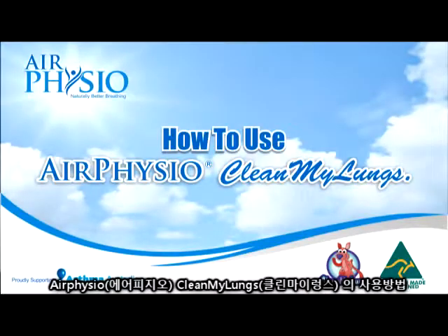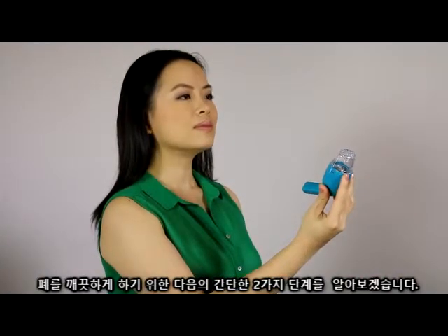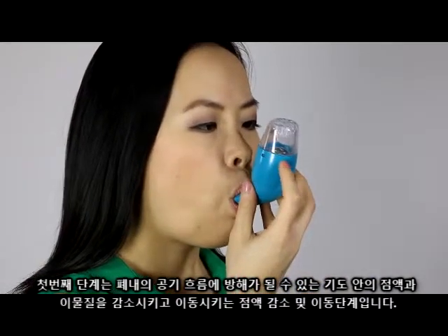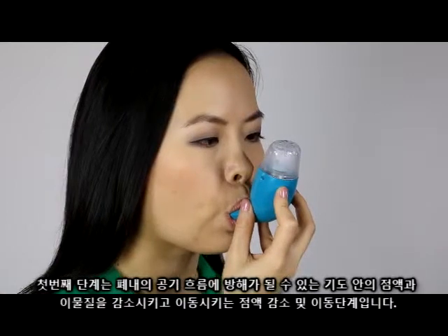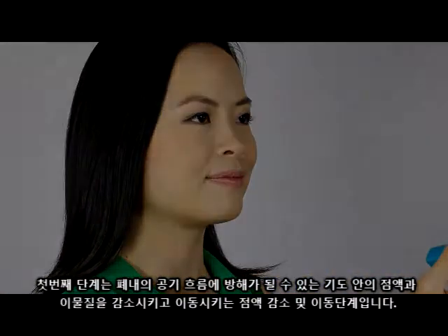How to use Air Physio Clean My Lungs. Use two simple processes to help clear your lungs. The first stage is called the mucus loosening and mobilisation process, assisting in loosening and mobilisation of mucus and blockages in your airways, which may reduce the airflow of your lungs.